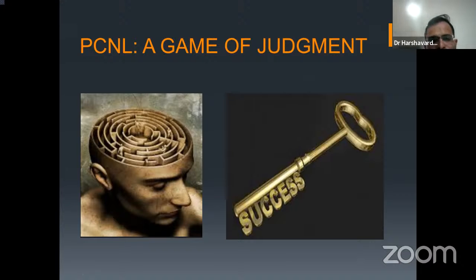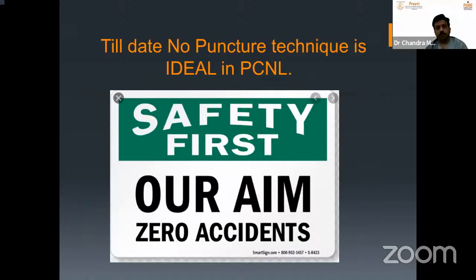Before doing a PCNL, there should be a roadmap which is very clear in the mind of the operating surgeon, because a good puncture is the key to success in PCNL. If you take a good puncture, 80% of the job in PCNL is done. If your puncture is not good enough, then you will be in trouble. Till date, there is no ideal puncture technique in PCNL.